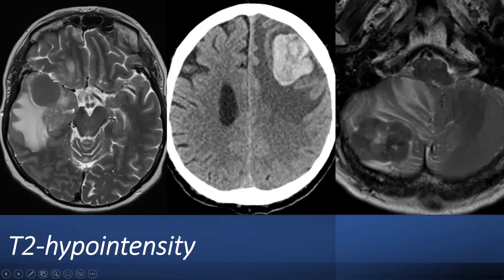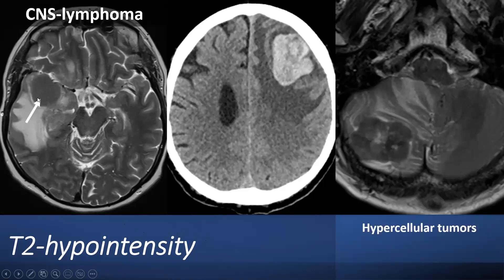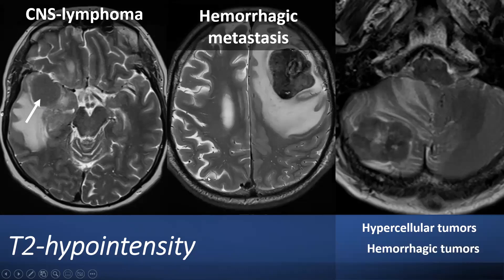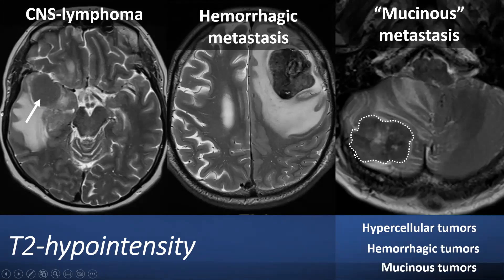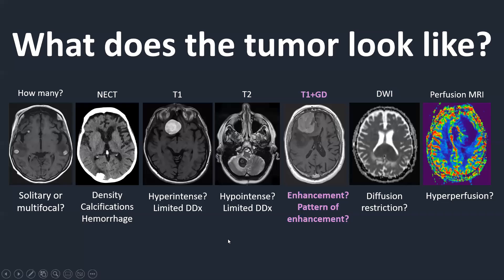For T2 hypointensity: CNS lymphoma is a hypercellular tumour with narrow intercellular spaces, not many water molecules, leading to a low T2 signal. Hemorrhagic tumours are pitch black on T2-weighted images. Metastases from mucinous primary tumours also tend to be T2 hypointense. So hypercellular tumours, hemorrhagic tumours, and mucinous tumours can be hypointense on T2.